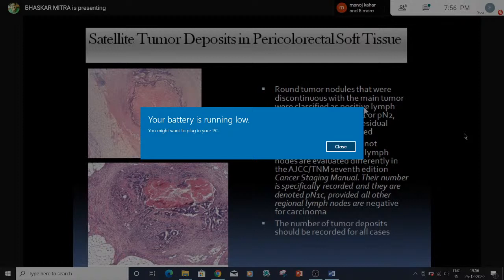First, it was the rule of 3 millimeter. When the 3 millimeter rule was there, tumor nodules spanning at least 3 millimeter were considered to represent completely replaced lymph nodes regardless of their morphology and classified in the N category. Smaller tumor nodules may be classified in the T3 category as invasion, like vascular or perineural invasion, in TNM5. Now, AJCC6 changed it to the contour rule. If it is a well-demarcated, rounded one like this, then we consider this in the N category. And if it is an irregular one, then we consider this in the vascular invasion category.